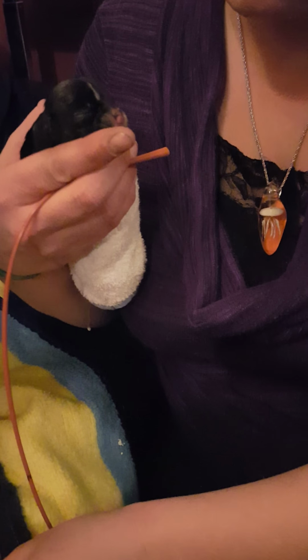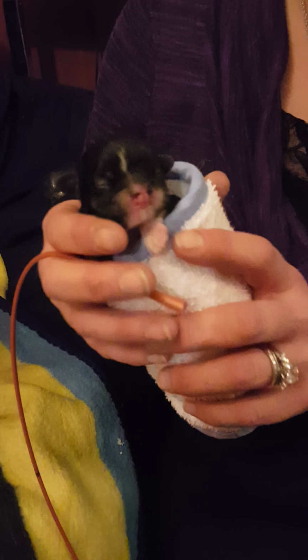It's okay, Jin. I know, baby girl. I know. Let me test the milk. A little warm, but by the time it gets in her, it's not going to be so warm. And then I'm going to fit an empty syringe on here. So this is to ensure that we get it down the right spot.